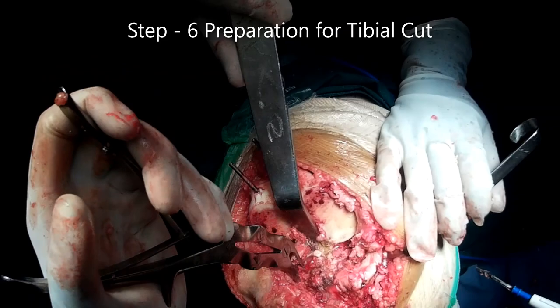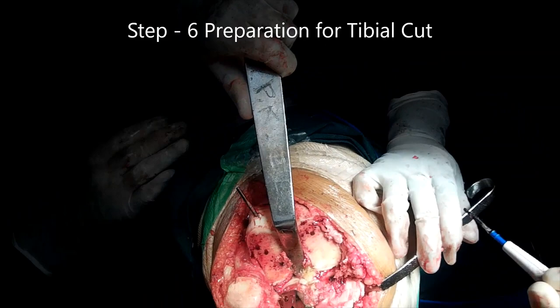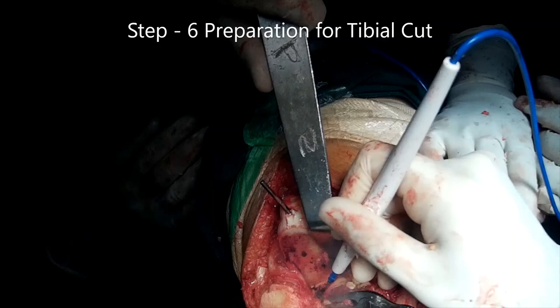The menisci and the remnant of posterior cruciate ligament are excised completely and anterior osteophytes over the anterior aspect of the proximal tibia are excised with the help of nibbler.